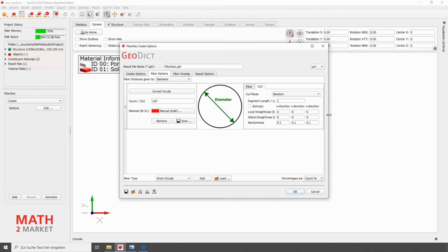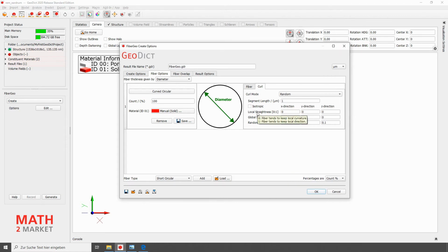Local straightness determines how much the fiber wants to maintain its current direction. If a low value is selected, the fiber retains its local curvature. The second parameter is global straightness. It determines how much the fiber follows the global orientation given for its type. If a value of 0 is chosen, the global orientation is ignored. If you choose a value of 1, it is always preferred.